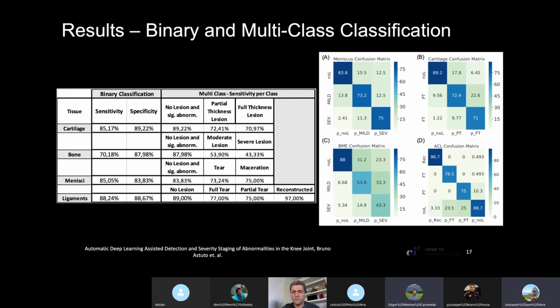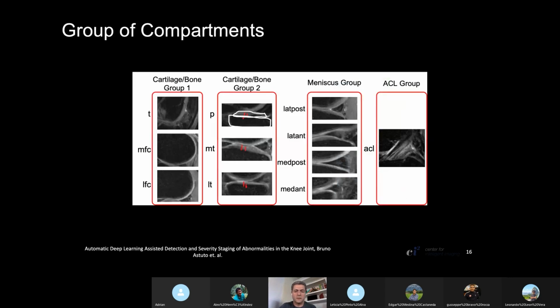Another question. You're showing the results independently, I mean you use a separate data set, right? Are you processing the segmentation part here or not? No, the segmentation is just to localize and do a pre-processing of the images, so I can crop and have images like this.